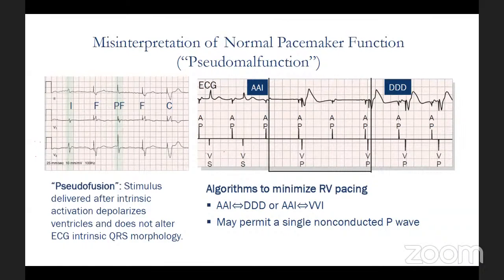This is actually one of the commonest causes of device malfunction. You get lots of consultations from the telemetry people telling you the device is not working, that they've seen failure to capture. They think the third beat you see there, where the A pace is, of course, most of these patients have some AV conduction disease, or sometimes it happens at night when the patients are asleep and you get strong vagal tone. Typically you see A paced, V sensed, and then the next one with a longer AV interval, longer, and then you see a drop. This is a slightly different example. Then you see atrial pace, ventricular dropped, and then the double AV pacing means the device is now switching back to DDD mode.